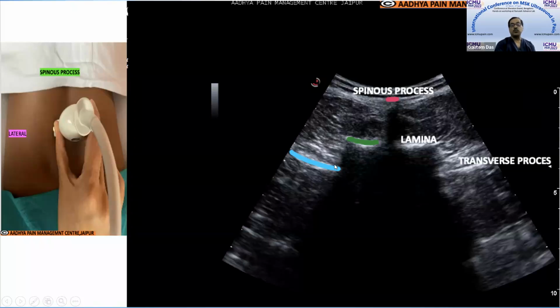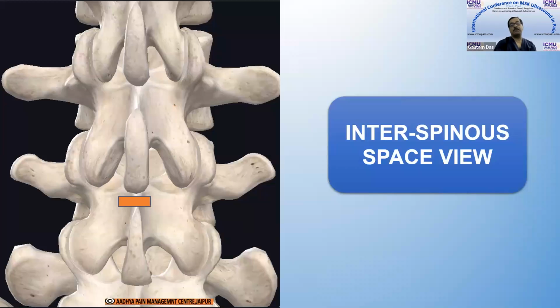As I was telling, sometimes, not always, we will see the artery. Normally the medial branch accompanies one artery here, so you'll be able to identify that. And in this view, if we tilt a little bit anteriorly or posteriorly, we might sometimes be able to see the plane between the psoas for the lumbar plexus.